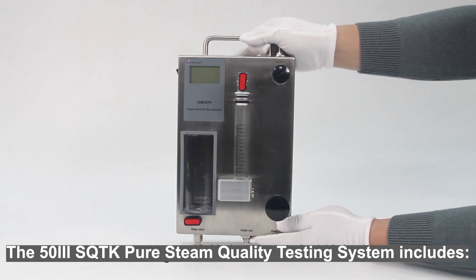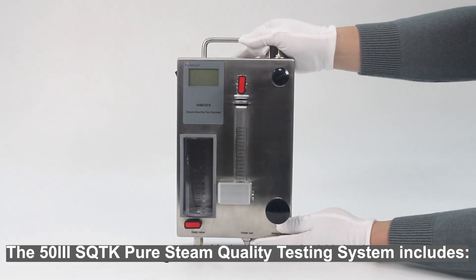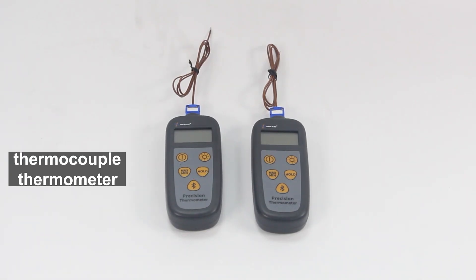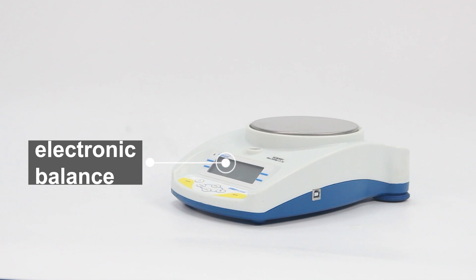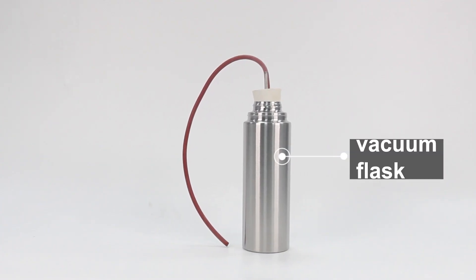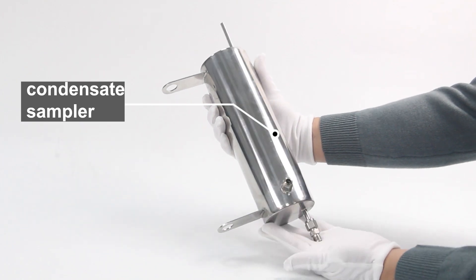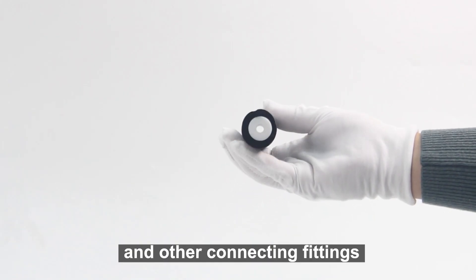The 50III SQTK Pure Steam Quality Testing System includes a non-condensable gas test device, thermocouple thermometer, electronic balance, vacuum flask, 316L pitot tube, condensate sampler, and other connecting fittings.